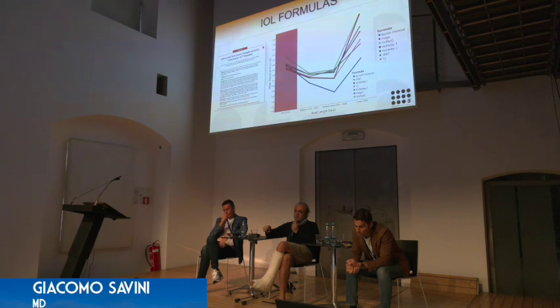After Kane showed this slide, it was at ASCRS and then published in JCRS. I think that everybody all over the world started using the Barrett formula that had been available for 10, 15 years, and nobody was looking at the Barrett formula. But after this paper, everybody, including myself, started using the Barrett.